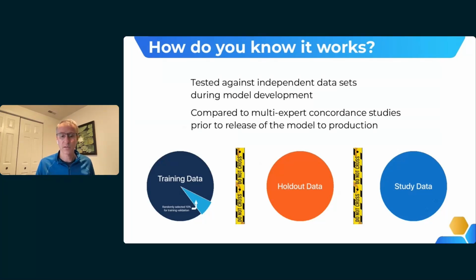to train our model is going to essentially be now kind of, I guess you could say, tainted, as in the model will now know perhaps something about that slide and be able to give good answers on that slide in the future. So we separate our slides into the training data, and a subset of the training data is used during the training process itself to test how well the model is learning the task. And so this is called validation.